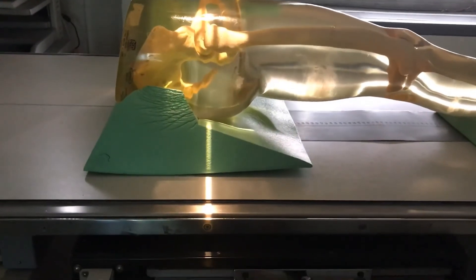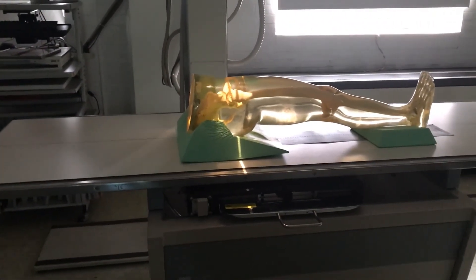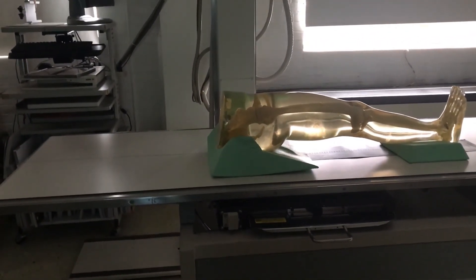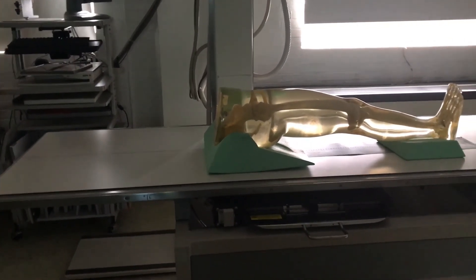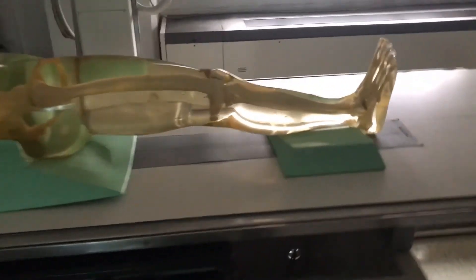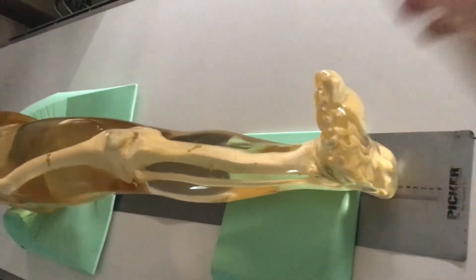I'm at a 7 by 7 for this exposure. Hip technique — say 20 mAs at 80, or this patient is probably more of a 32-ish for a hip; it's a solid leg. He is positioned in a true AP just like a hip — turn that foot in 15 to 20 degrees for your AP hip. So make your exposure.